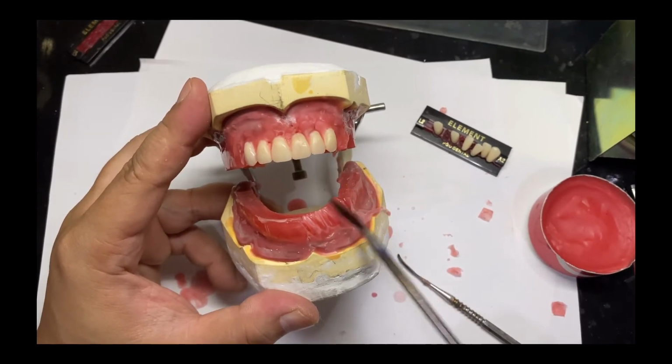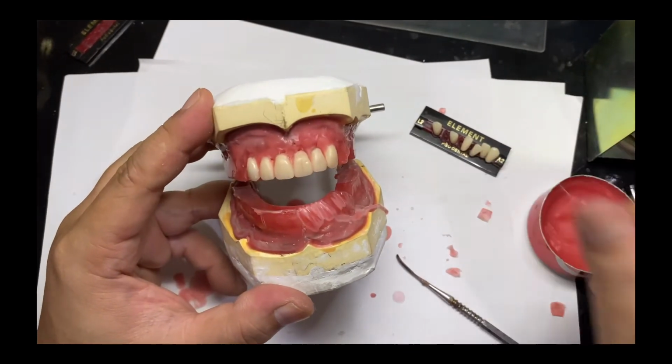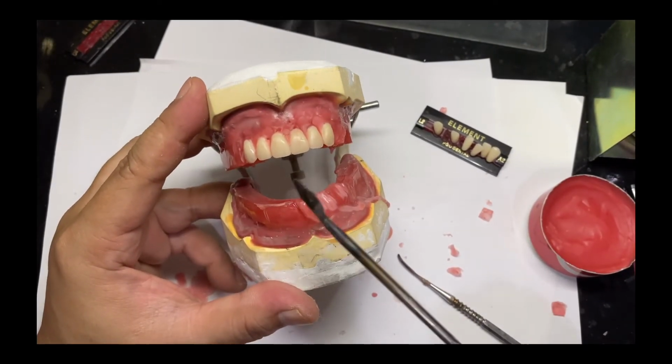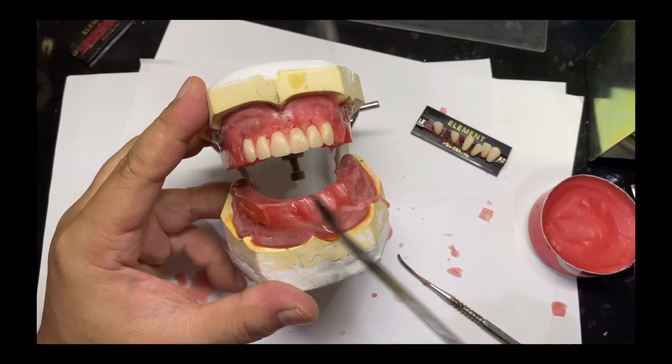Or you may also use the chart that I gave you. First I'm going to set the two central incisors, again to maintain the midline.